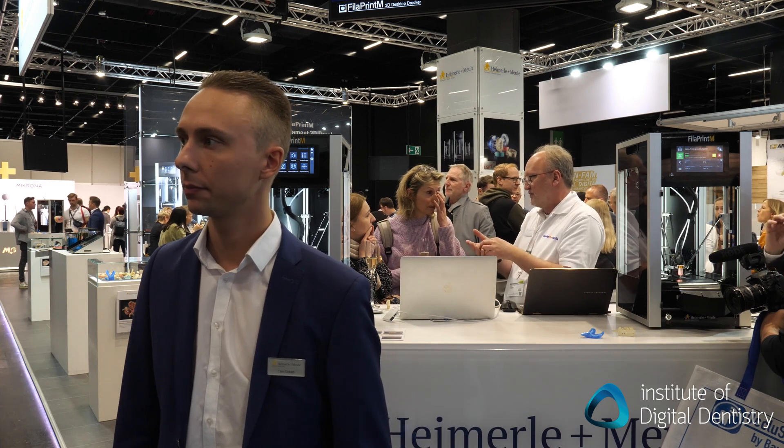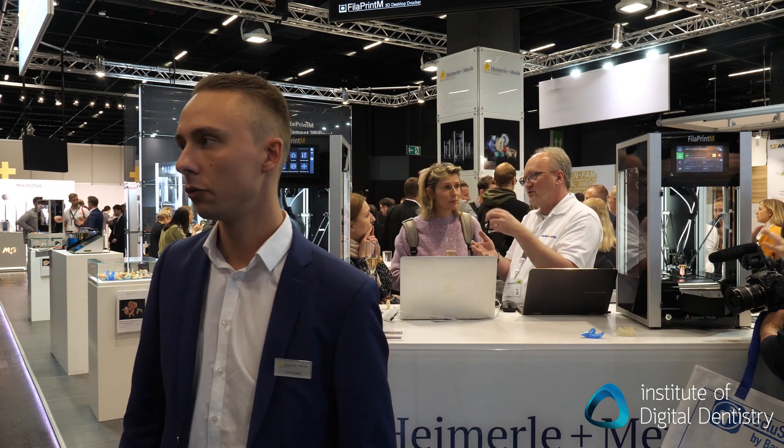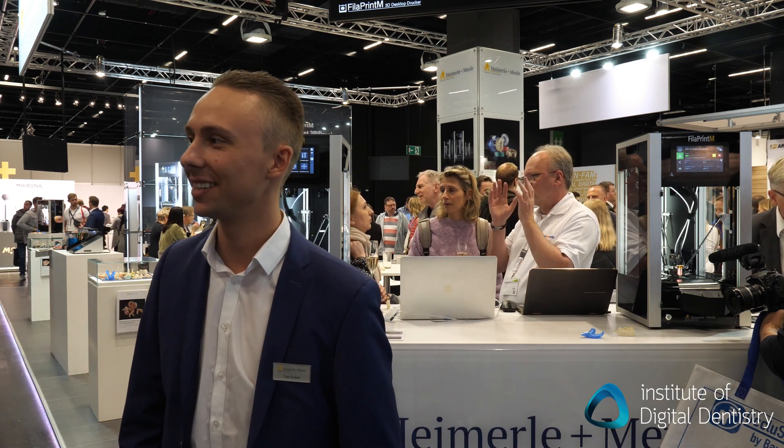So you've gone through biocompatible filament approvals for biocompatibility? Yes. So you can also do partial dentures, for example. Our materials are also suitable for allergic patients and they have no additives. So it's a really good product made in Germany.